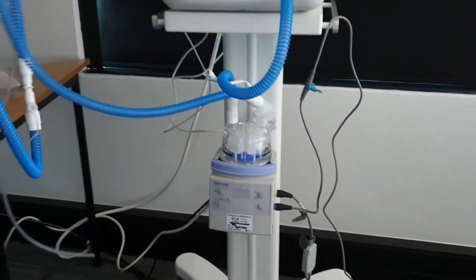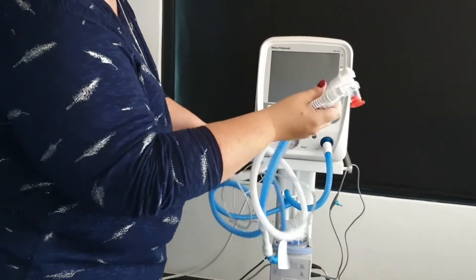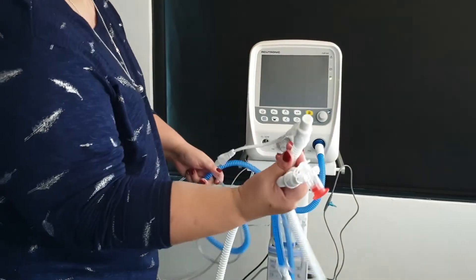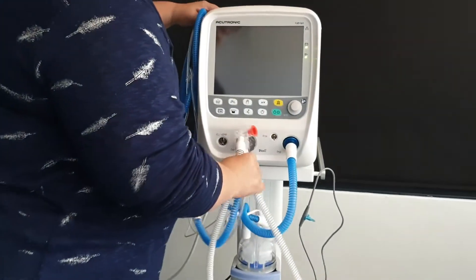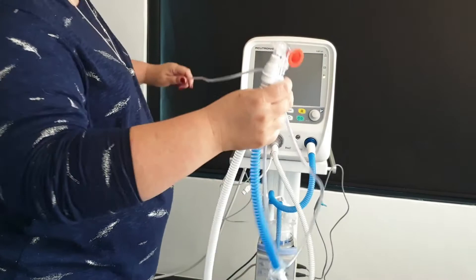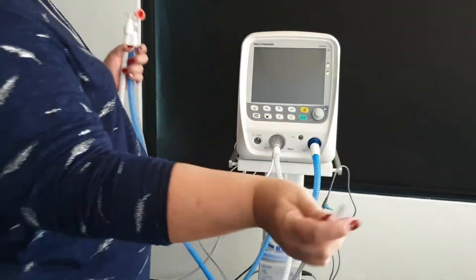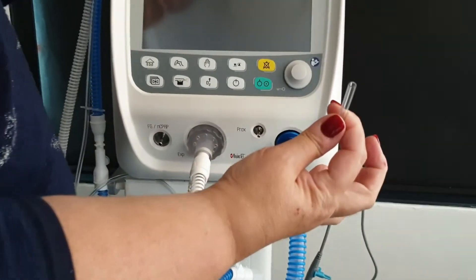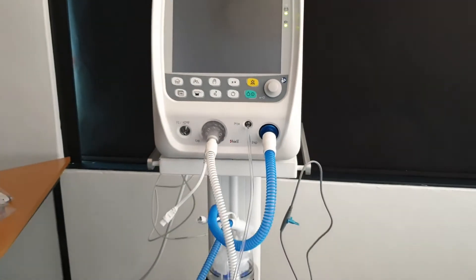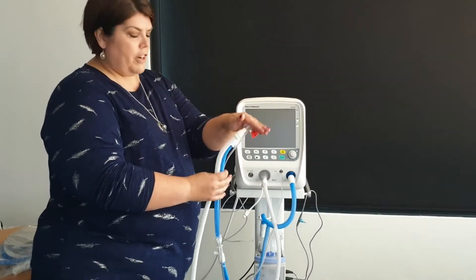The white expiratory limb will bring the gas back to your machine. You then have a proximal line on the ventilator — the purpose of the proximal line is to measure your pressures. It connects to the proximal port and basically slides over to connect at your patient.